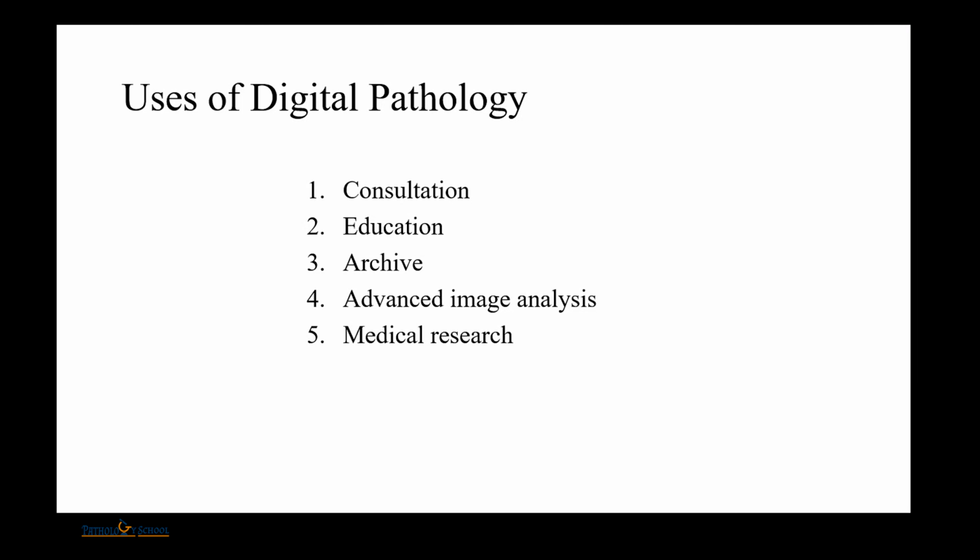Then next is your education. This VSI devices have been used to create a virtual slide box, just like the slide box that we have. It was started by Dr. Fred D in University of Iowa. Also, University of Michigan has their own website where they have each organ system wise on the website.